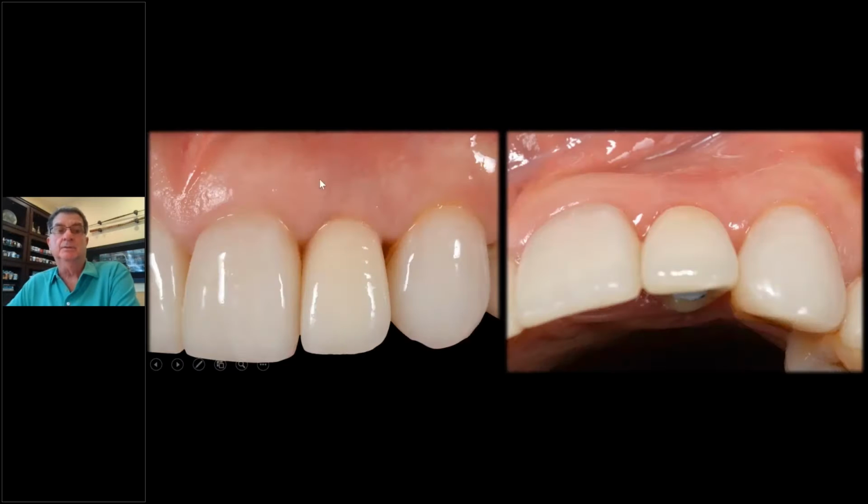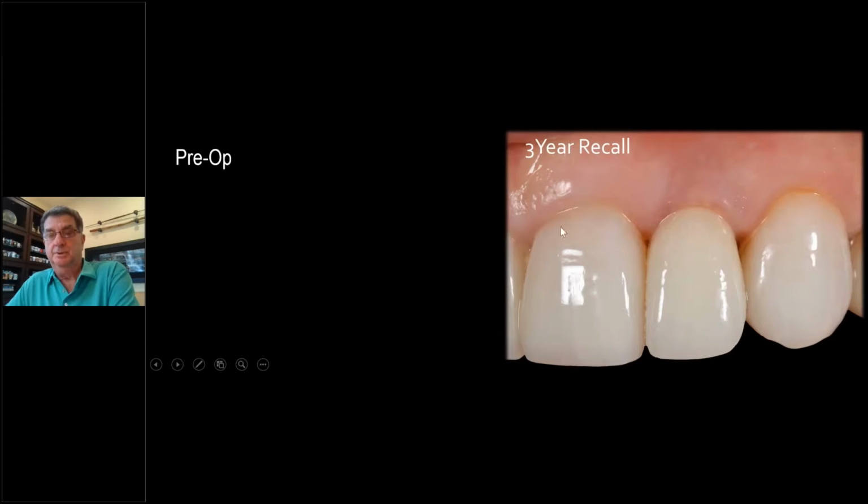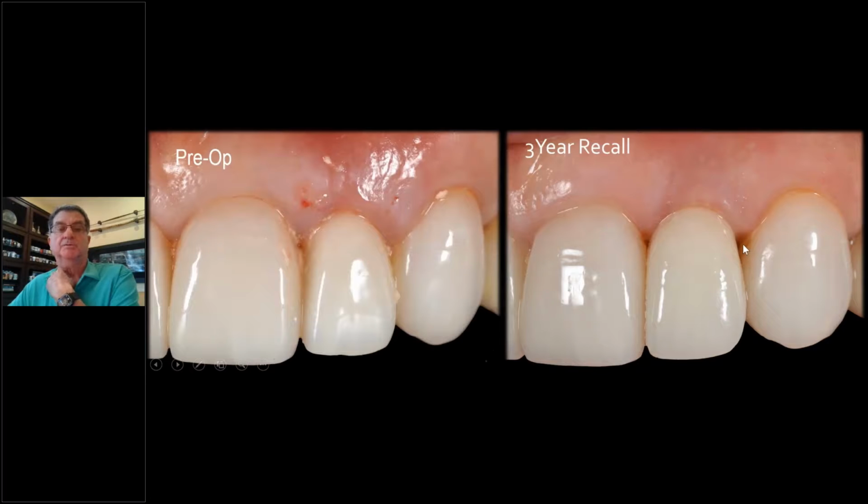Here you see it, and we have a pretty good result for 1 stage, 1 surgery, 1 time. The tissue's covering it, not bad thickness, and we're in pretty good shape. There's the bone grafts, that's at 6 months later. You see the bone is still in there. That's good. And here is the 3 years. She doesn't have great hygiene, but 3 years later, we're maintaining this well. And here's the pre-op. This is what she came in with, the fractured tooth. Minimally invasive surgery, a happy patient, and that makes us happy.